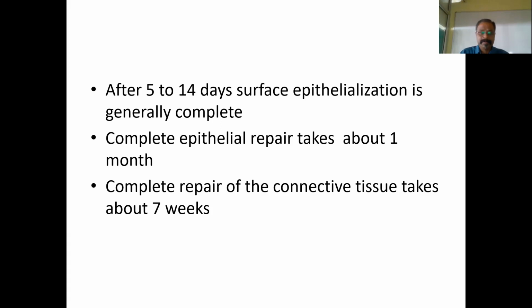Then we spoke on the excisional new attachment procedure, ENAP, devised by Yukna, which usually uses a knife. That is what differentiates it from curettage. And I said that you can use an ultrasonic scaler to do the curettage procedure also.